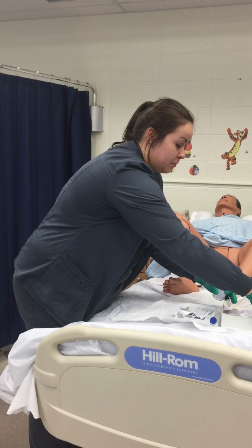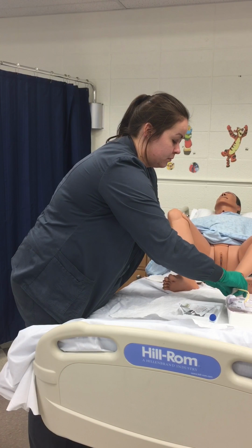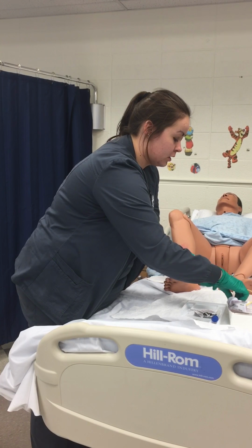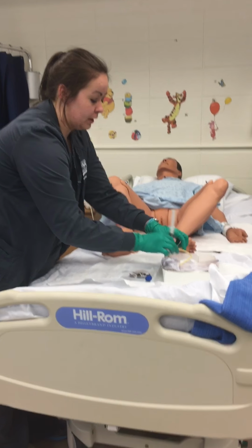lubricate my Foley tip about 2 to 3 inches, and attach the syringe filled with sterile water to my Foley.